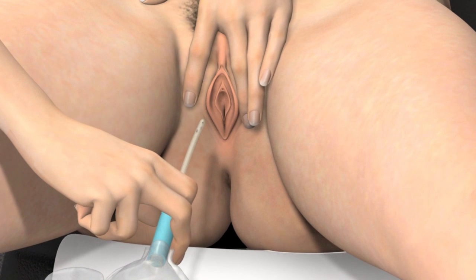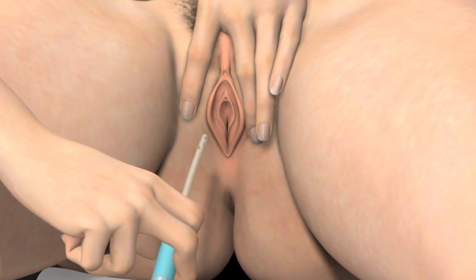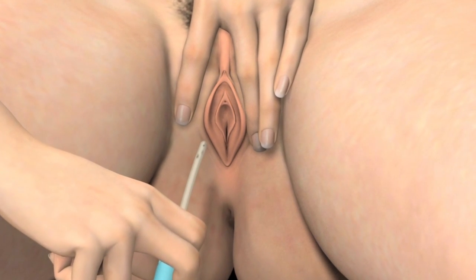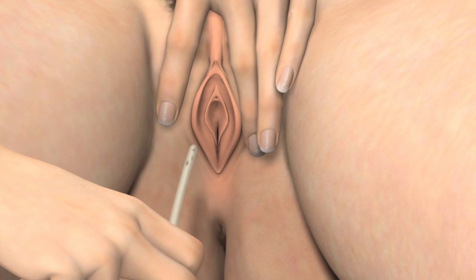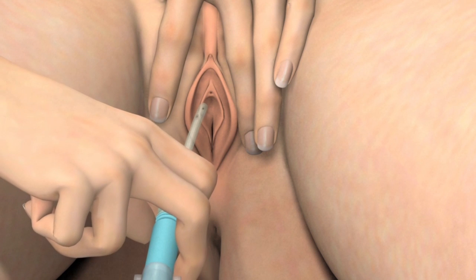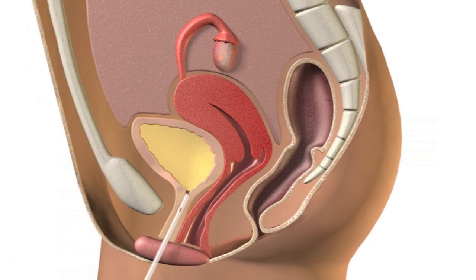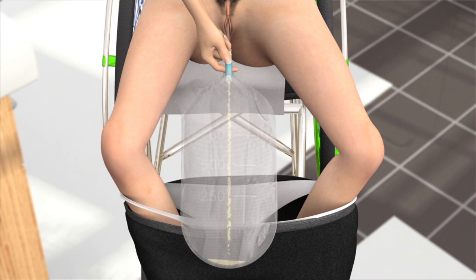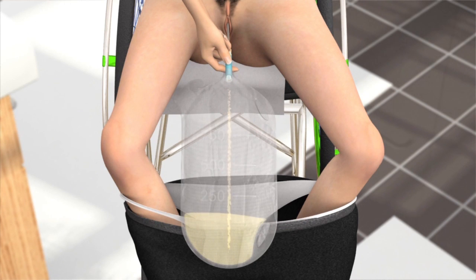To make insertion of the catheter as easy as possible, it is important that you relax. Slowly and gently insert the catheter into your urethra. Make sure you use gentle movements. Continue to insert the catheter until it reaches your bladder and the urine starts to flow.